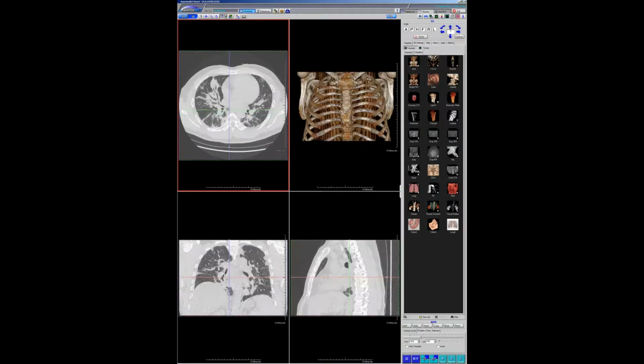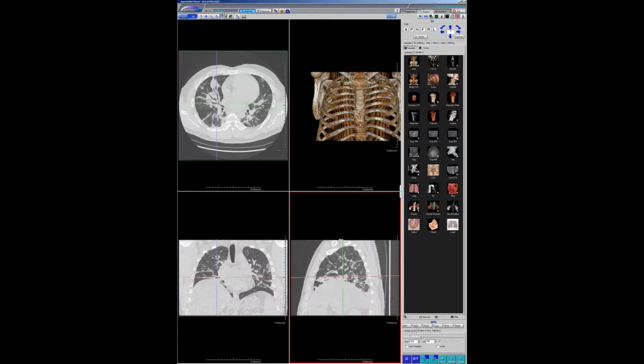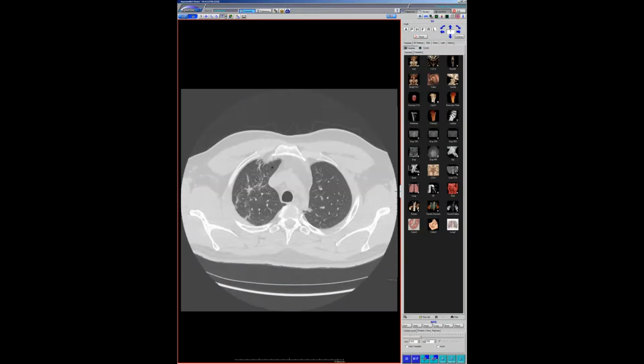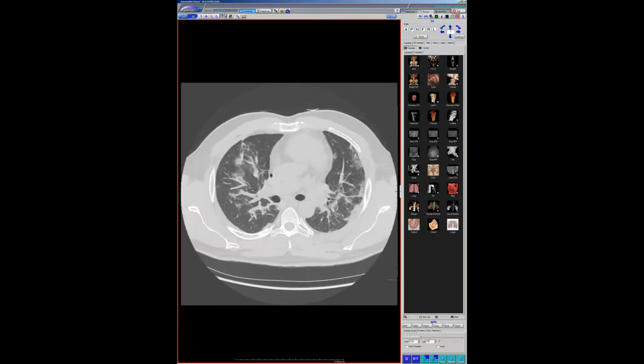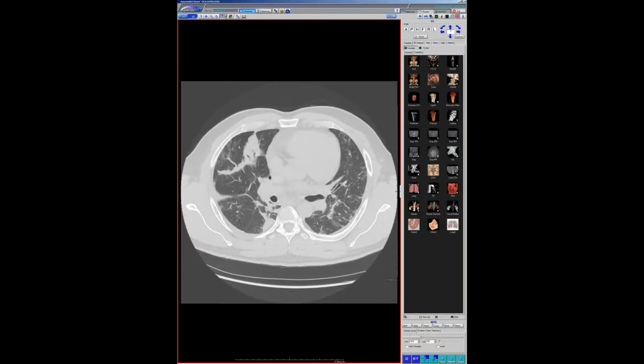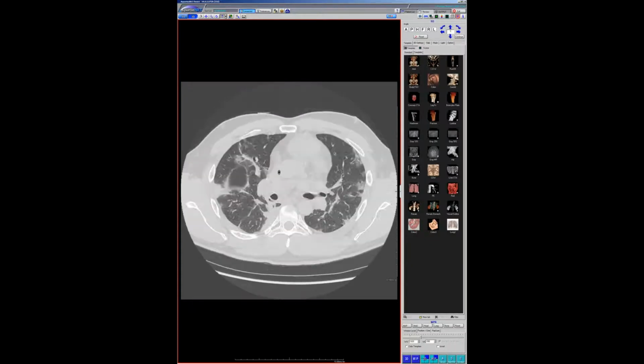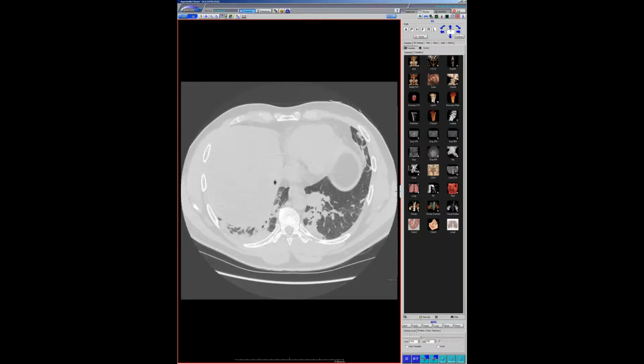Yeah, we've got 30 some cases now, and really, oh, wow. And I would say that it's often a patchy pneumonia, particularly in old people. And you wouldn't say COVID. You'd say there's a patchy consolidation and, you know, likely pneumonia, period. That's exactly what I told my guys to say. Often looks like a bacterial pneumonia. And there are so many cases that don't have that classic China look, that nice ground glassy stuff. A lot of them look a lot more like bacterial pneumonias with dense patchy consolidation. So I would not try to say it's a typical pattern.